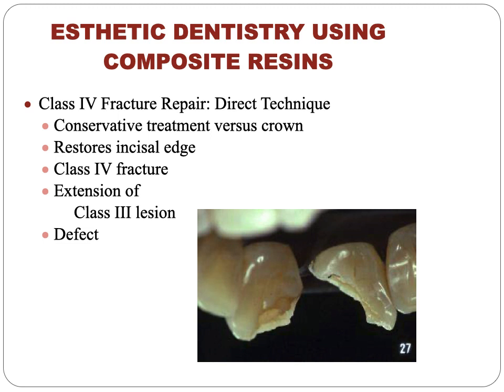As you see in this photo, we have a large part of the structure missing. So repairing this part with a direct composite restoration is more conservative than making a crown for this tooth and using an indirect crown for restoring it. So this treatment is considered more conservative compared with indirect crowns.